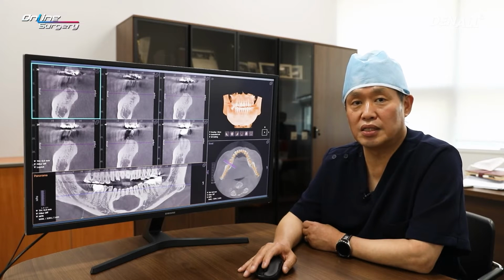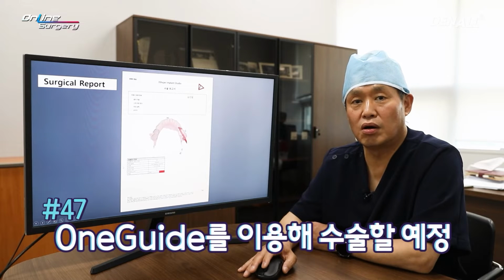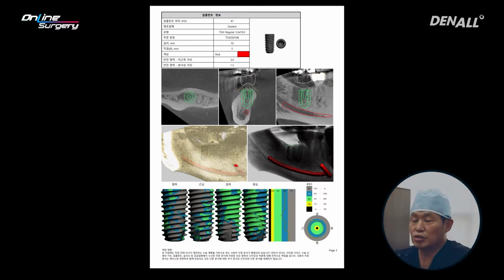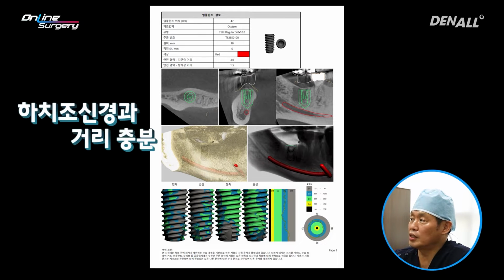So Osstem OneGuide system is going to be used to place the implant in the accurate position. Using virtual surgery, I plan the case and the distance with the inferior alveolar nerve is sufficient.